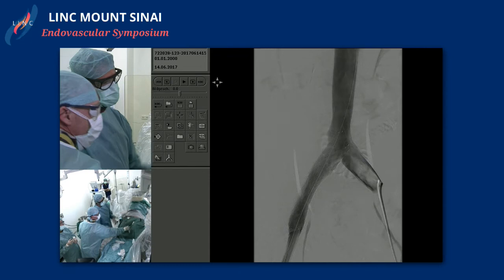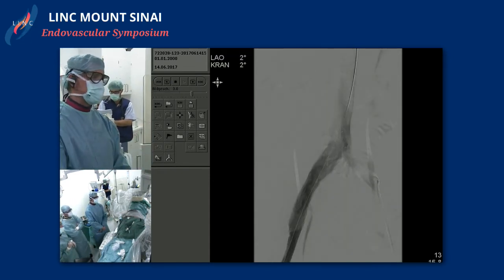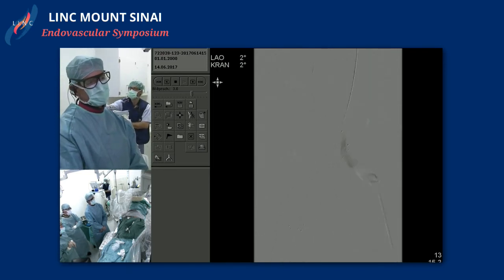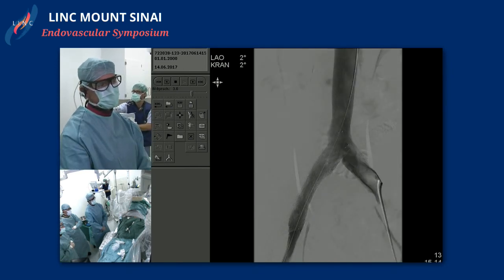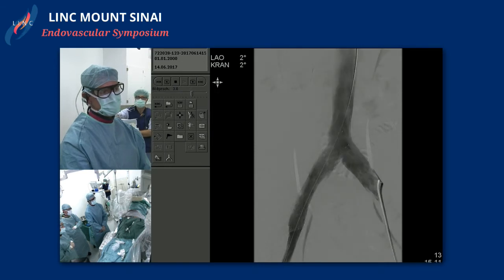Yeah. I think it's quite nice. I mean, it can be some millimeters further into the right side, but altogether I think there is good flow here from the left side, not going to the other side of the cava. So I'm actually quite happy with this position here. No, I think it looks ideal.